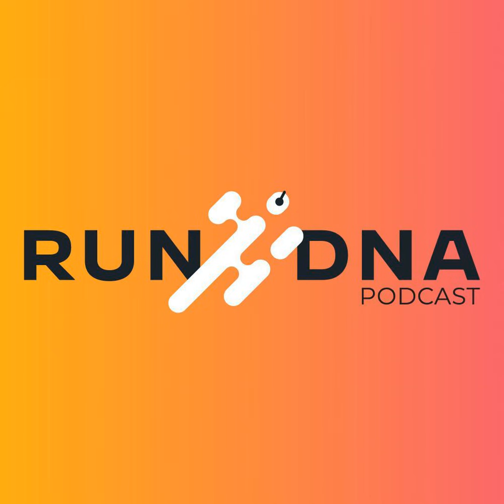I think that's one of the biggest things there, is being able to see this. You can bring up graphs, or you can bring this up and they can kind of see. This is where I use those heat maps, I call them, of the blue and the red streaks, basically, where you use that as a great gait retraining tool to let somebody understand, hey, I want it to look like more of this. And then they play around with it live to see how that feels. So that might be something that is really helpful as well. That's a good one to use here. But I like some of the concepts.